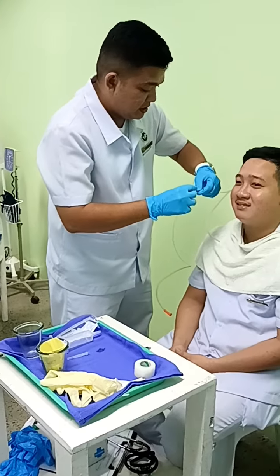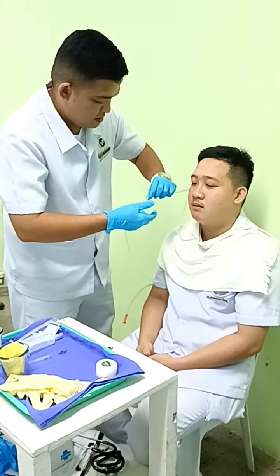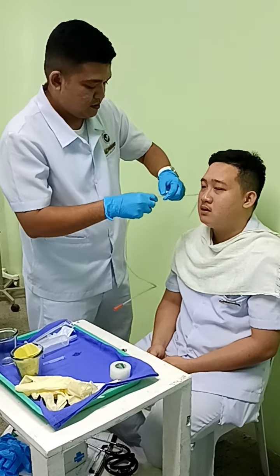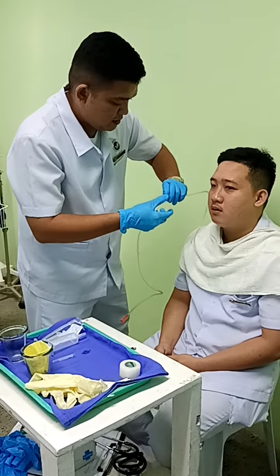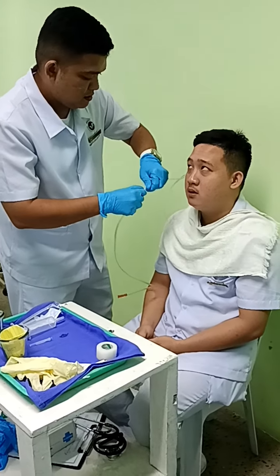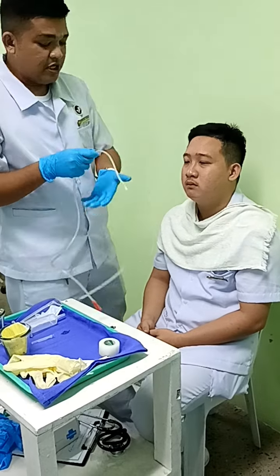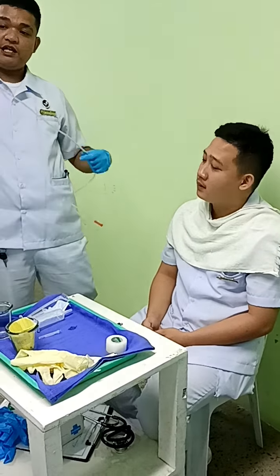Once we have reached the nasopharynx, we're going to further insert the tube. If the patient is experiencing respiratory distress, it is important that we remove the tube. Next part is to lubricate the tube.